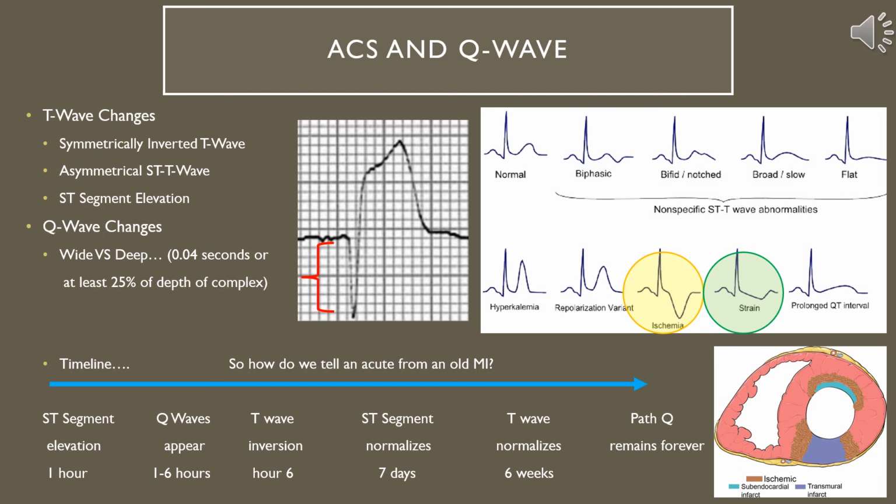By its nature, infarction and cell death is a permanent change in the EKG. When you see it in at least 2 leads of the same lead group, this usually will indicate infarction. It appears during the acute phase of the MI and will remain when the T and the ST segment changes have both returned to normal, because the pathological Q will remain forever.